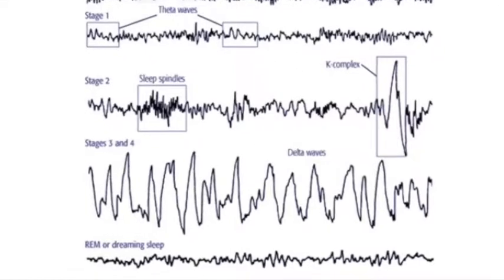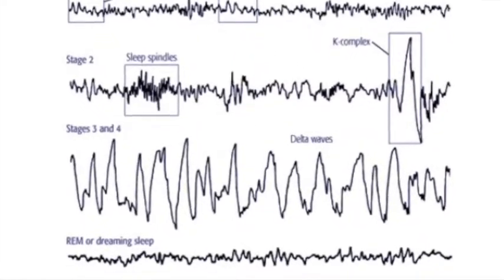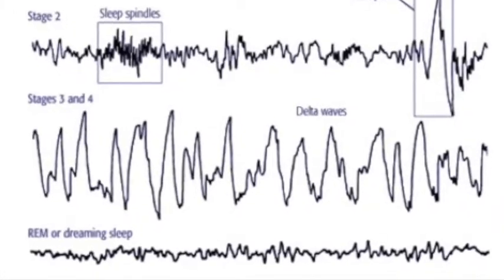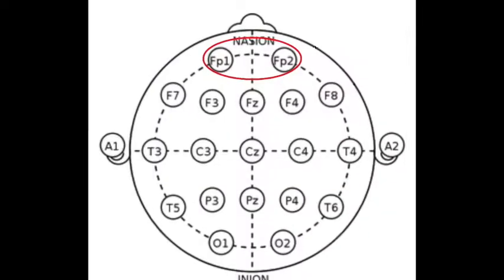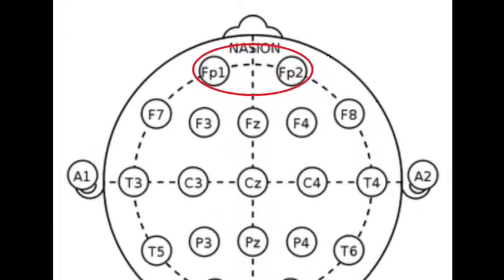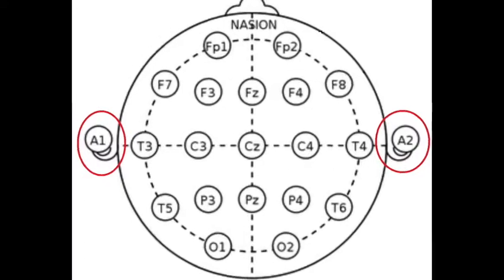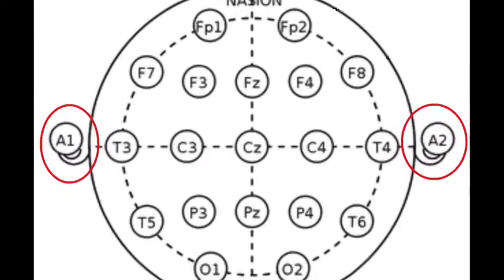Delta rhythms occur when the frequency drops to 3 Hz or less. Delta rhythm is measured so that when the patient falls asleep, the music and lights will shut off if they are not already. FP1 and FP2 electrodes measure two different signals, just like O1 and O2, which our algorithm differentiates and processes accordingly. Electrodes at A1 and A2 are placed as reference electrodes on the right and left mastoid.